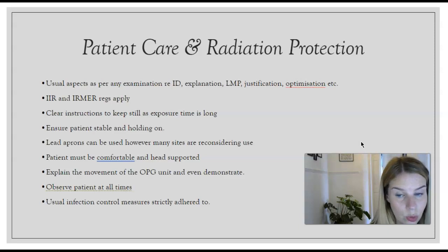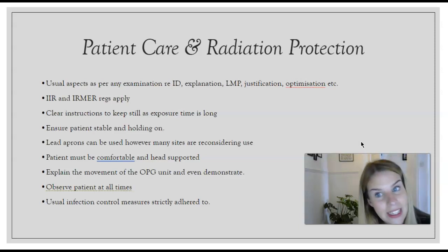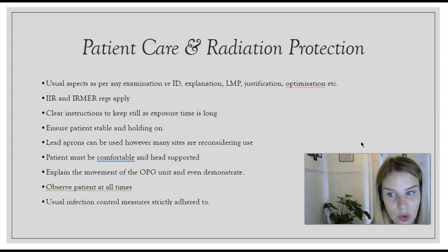Again, it's really important to observe your patient, which you all know anyway, and adhere to infection control. So obviously it was important before, but it's even more important now to make sure that you are wiping down that machine, changing the bite block, just adhering to strict infection control procedures as much as possible.